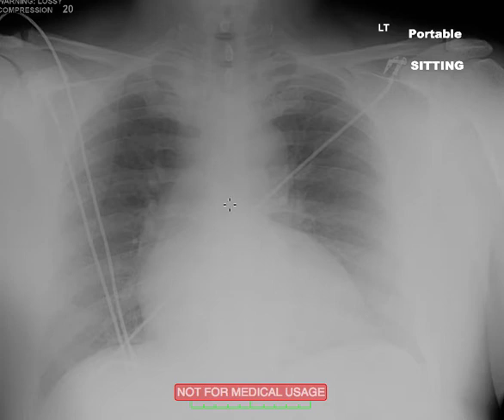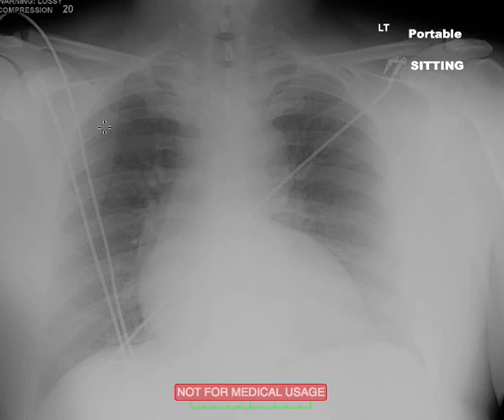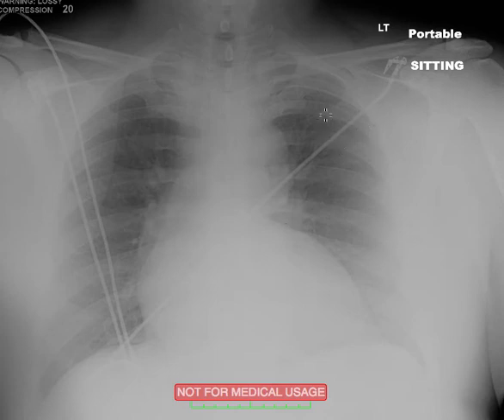It's important to evaluate the vessels. Here you see pulmonary vessels that are tapering nicely. They are very hard to see at all as you follow them out distally. So the pulmonary vasculature in this case looks pretty normal.